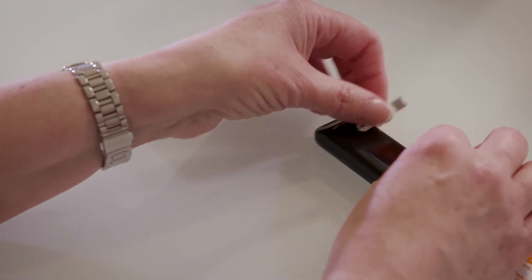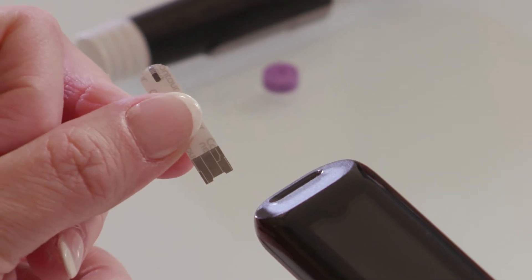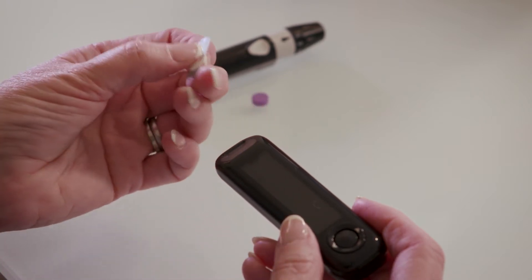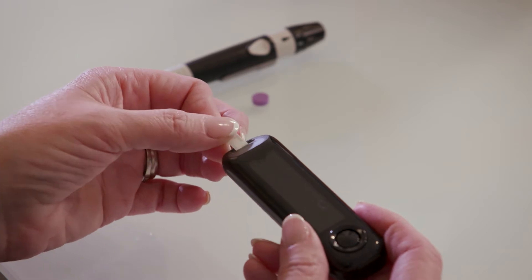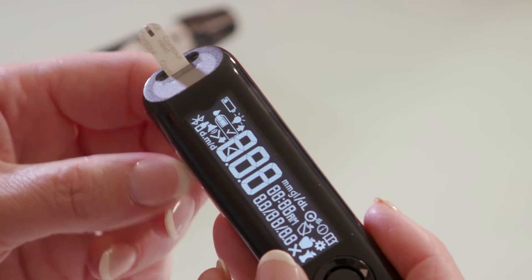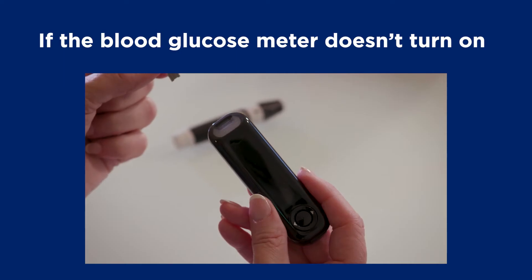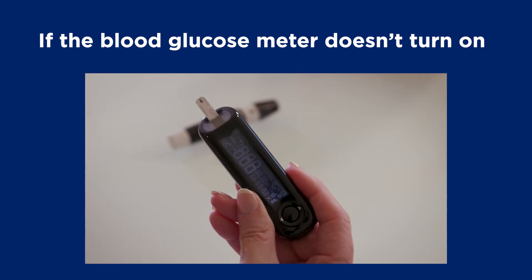Next, pick up your meter and test strip. You'll notice that one end of the test strip is square and the other end is slightly rounded. You'll also see that one side is printed and the other side is plain. Holding the test strip with the printed side up, put the square end into the meter. The meter will beep and turn on. A small test strip with a blood drop will flash on the meter display, telling you to apply a drop of blood. If it doesn't turn on, make sure you've pushed the strip all the way in and that it's inserted the right way.